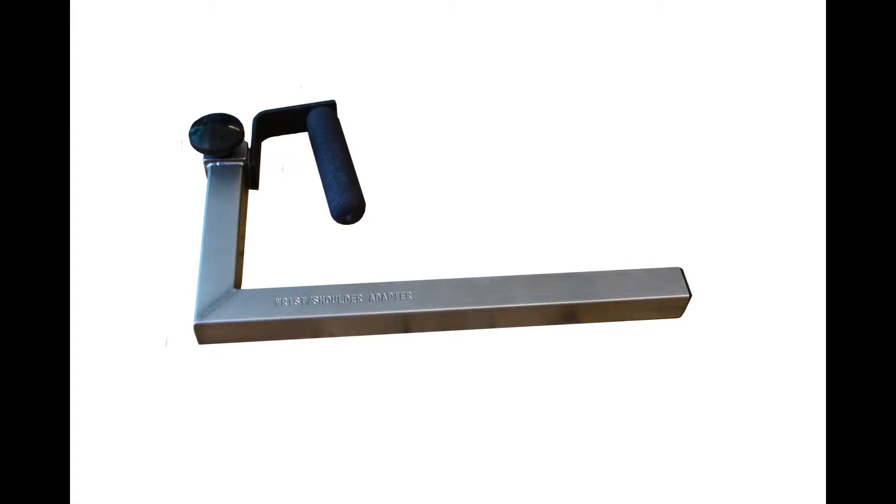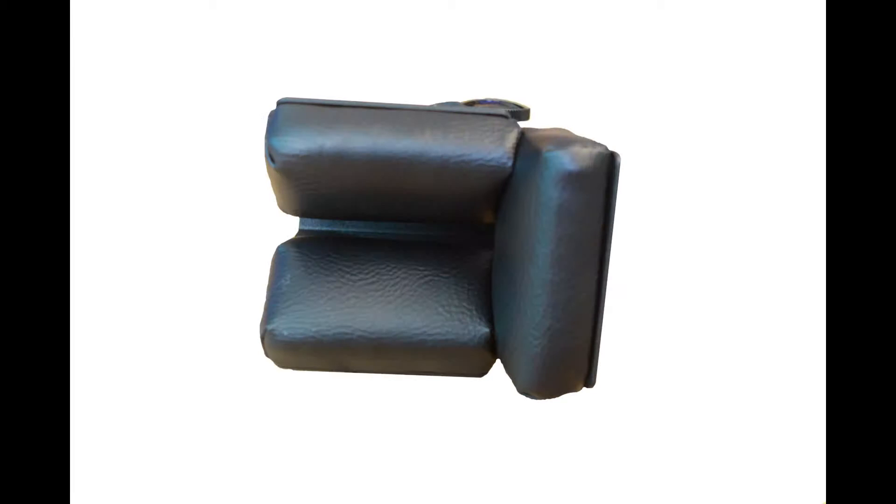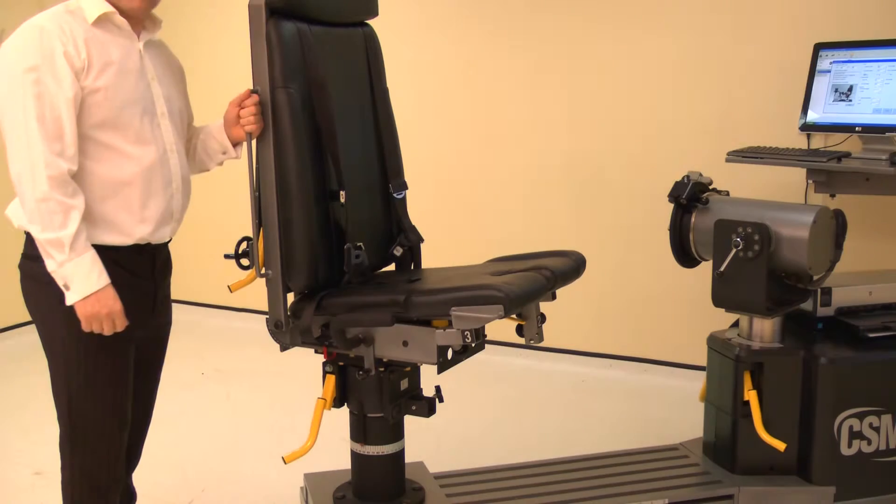We will need the wrist shoulder adapter, elbow stabilizer pad, and the lumbar cushion may be needed for comfort. Now adjust the chair rotation.